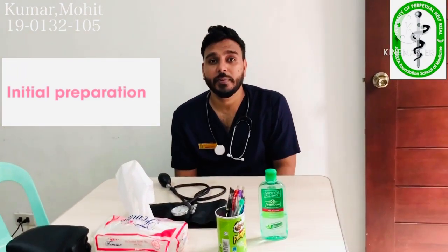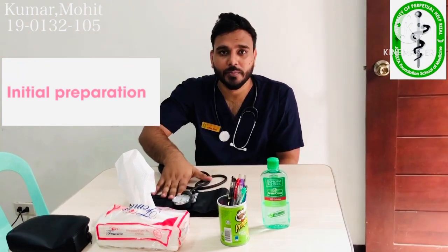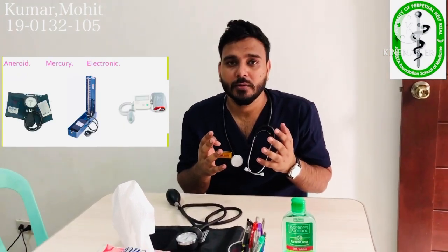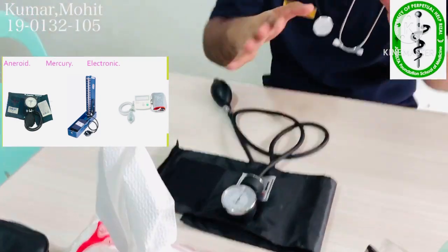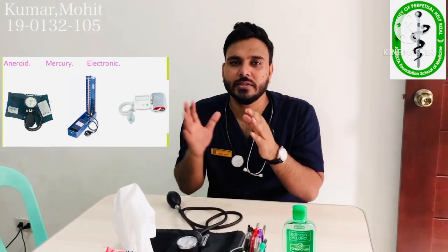We have to know what the requirements are for taking blood pressure. First, we need two devices: one is the sphygmomanometer and the second one is the stethoscope. We have three kinds of sphygmomanometer: the aneroid, the mercury, and the digital. We have the aneroid one, so we are going to take the reading through the aneroid sphygmomanometer.